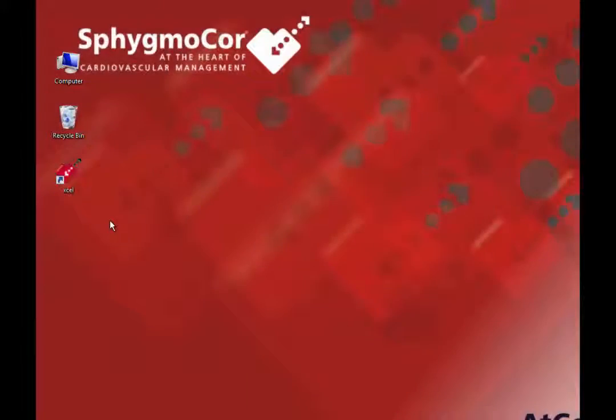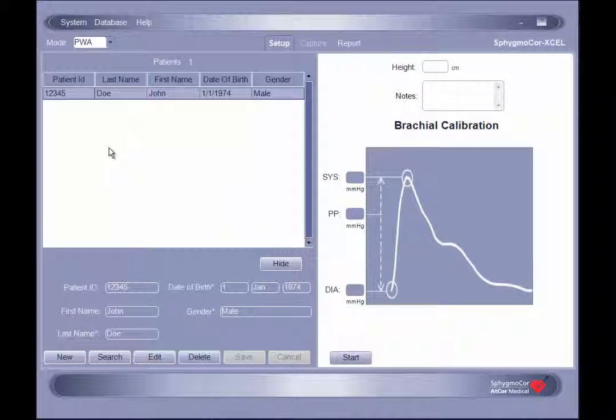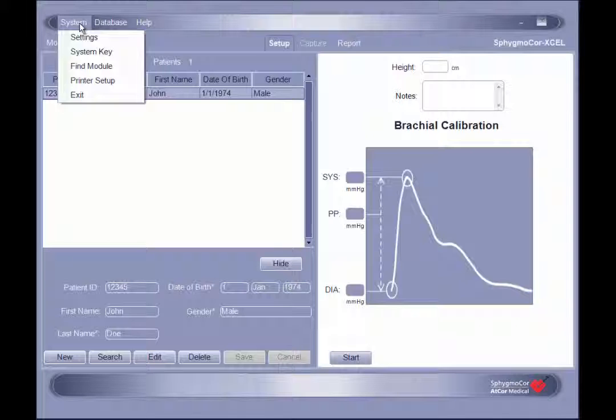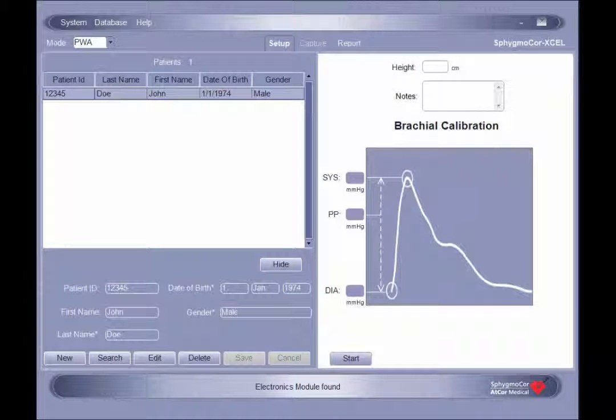To get started, on your computer desktop, double-click the Sphygmocore Excel icon to launch the application. To establish communication between the software and the Sphygmocore Excel module, click on System in the upper left corner of the toolbar and select Find Module from the drop-down menu. If communication has been successfully established, a message stating Electronics Module Found will be displayed in the notification area at the bottom of the screen.